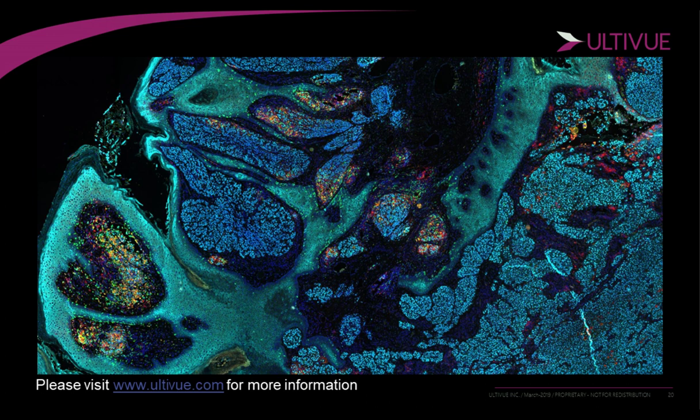Okay, our next question. Have you done extensive calibration between cell culture and tissue slide results? Yes. Defining extensive would add a little clarity, but we've worked with cell culture lines in some of our controls during assay development to understand how well our assay is functioning. If there's more to that question, I'd love to hear more about what you mean by extensive, and I'd be happy to discuss that offline.